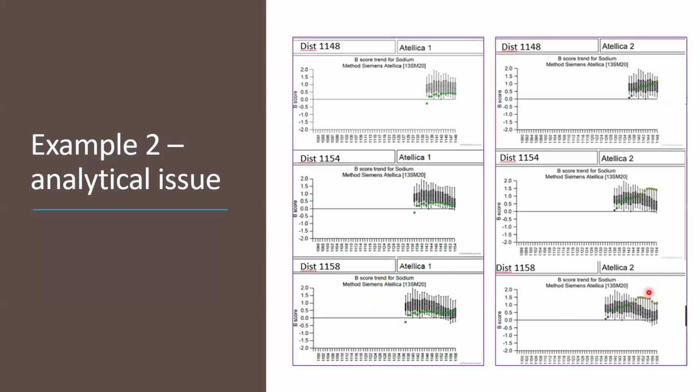This one was a little bit more complicated. This one is to illustrate an analytical issue. In our lab, we use the Siemens method, Siemens Atellica, to measure sodium.